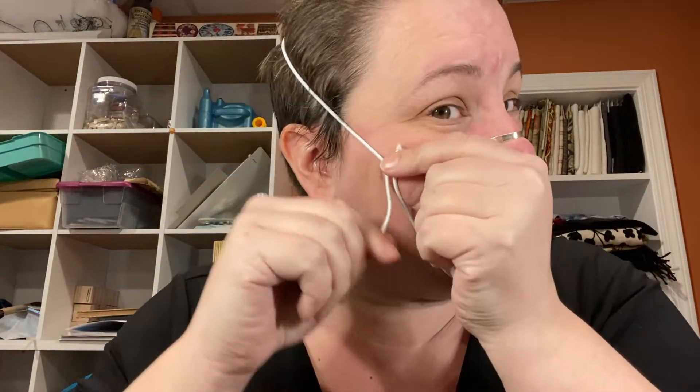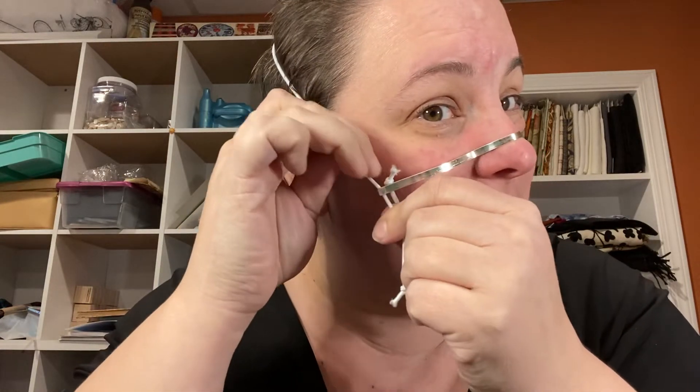What's nice about the elastic is it holds whatever material right up against your face but still allows you to speak and move your mouth. And then on this side this is the other adjustment, so if it's too tight I just stretch it and slide it up and down.